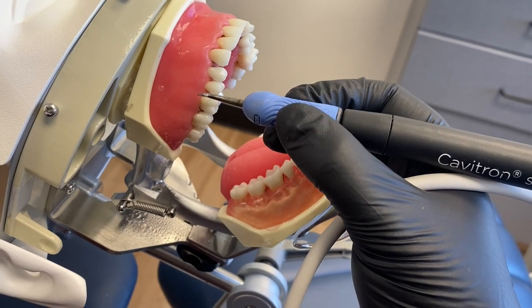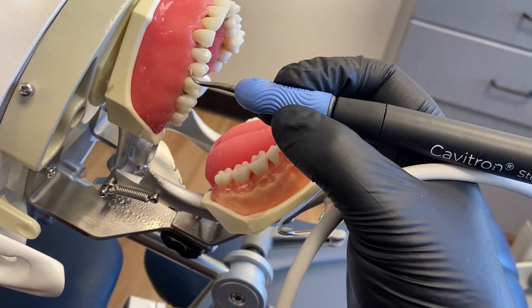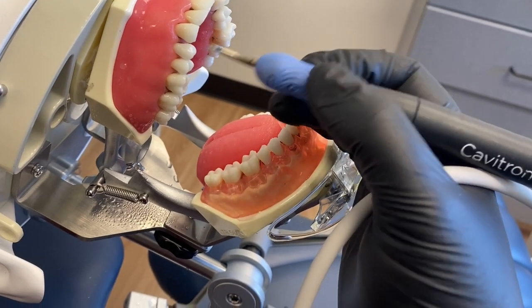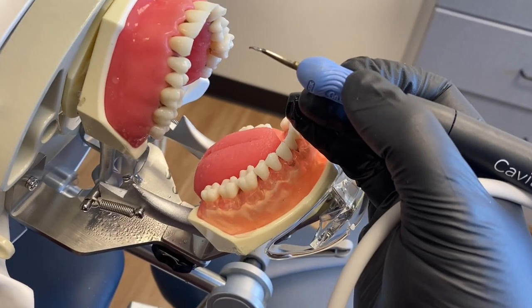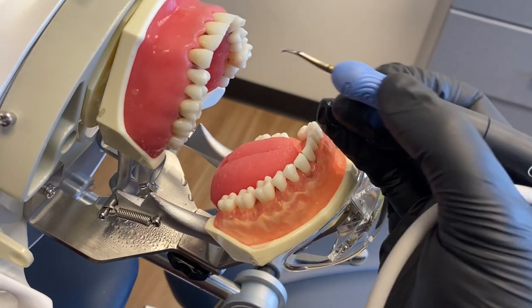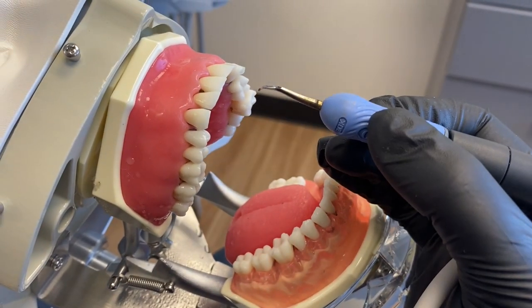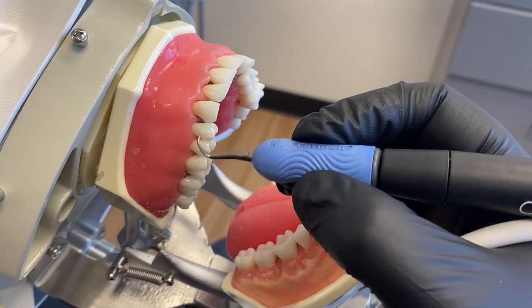How long should you be using your ultrasonic on a patient? Honestly, it depends — how tenacious their calculus is, how much calculus they have, how much inflammation, how deep their pockets are, etc. So we can't say 'I'm going to ultrasonic for 10 minutes every patient.' Every patient is so different.